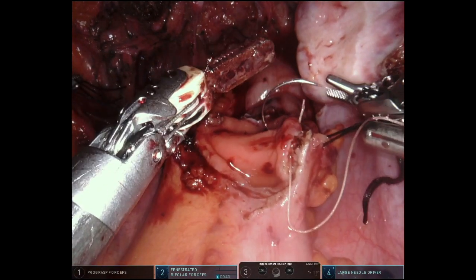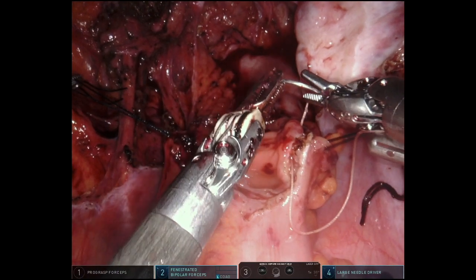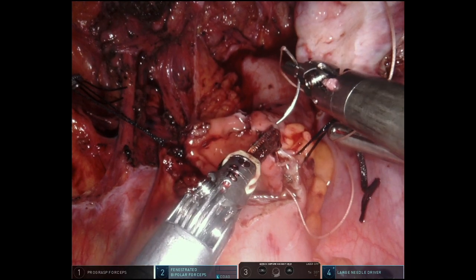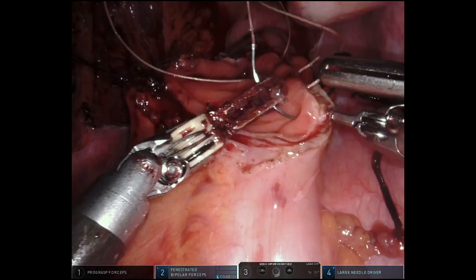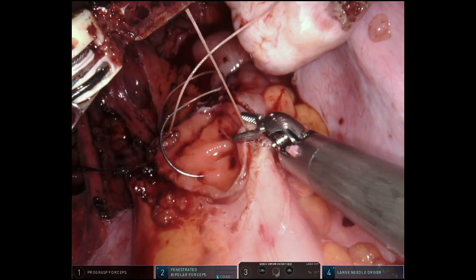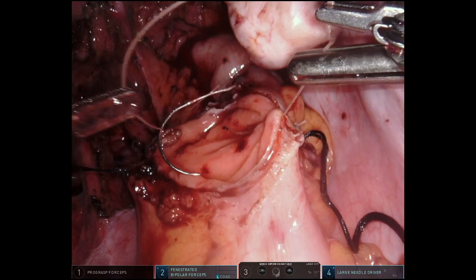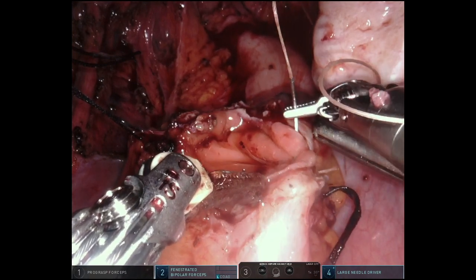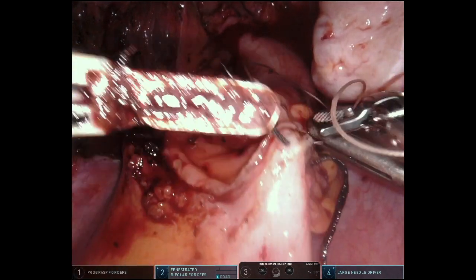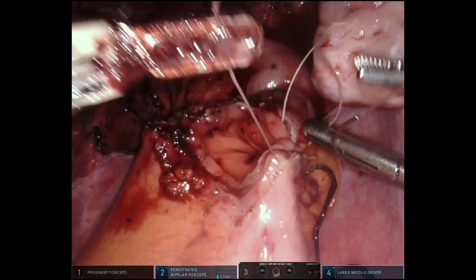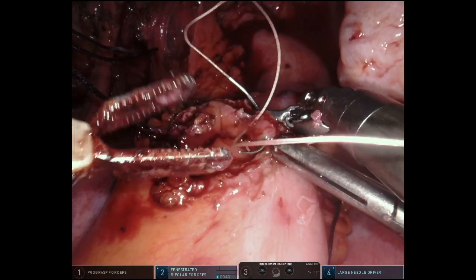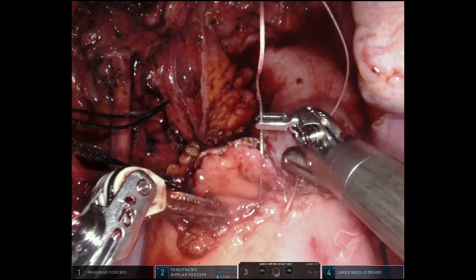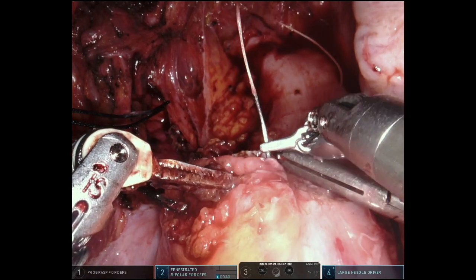With each suture, we see a small amount of closure until we finally have the entire incision closed. A defect that looks perhaps too large to close in fact closes quite well when we take it in a step-by-step fashion. One can see that what starts as a side-to-side placement of the needle starts to become a more vertical placement of the needle as the incision starts to close. As we near the opposite edge of the incision, it is very important to include the corner well so that we do not have any leak from the edge.